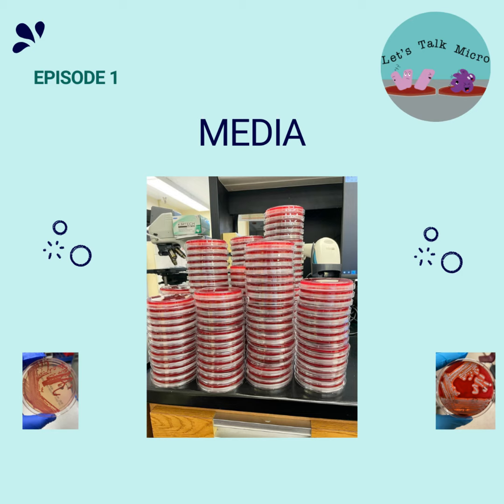So I worked this culture, and this was before the MALDI-TOF days. For those of you that know the MALDI-TOF, you get an ID really quick. My hospital at that time didn't have one, so we were still doing the Vitek. So I go ahead and I'm working my gram-negative rod. It's growing on Mac. I set up a Vitek. And then the next day, this is the wound bench, there's not a 24-hour read. So basically you work it up and then the next day you find out what it is.